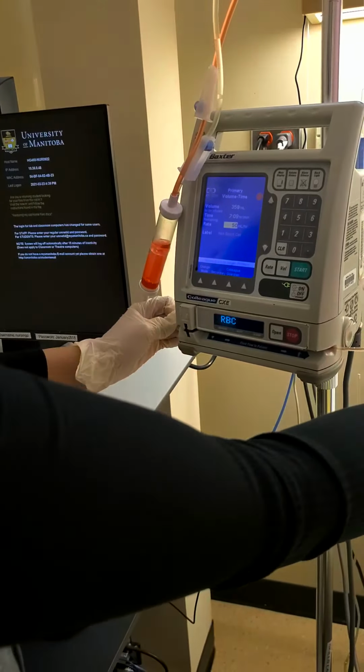So we're gonna clean his saline lock here. We're gonna clean for 30 seconds. Then we're gonna allow 15 seconds to dry. And we're going to flush it. So now that it's flushed, we can connect the line here.